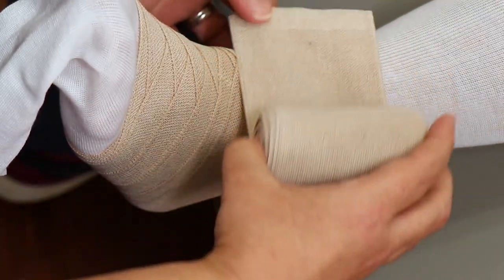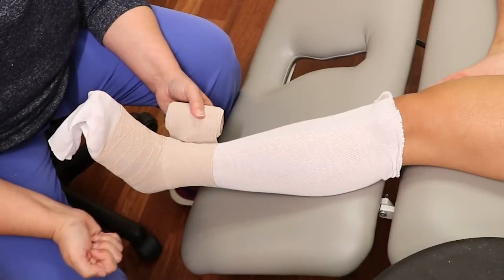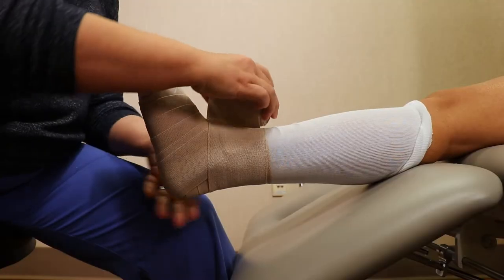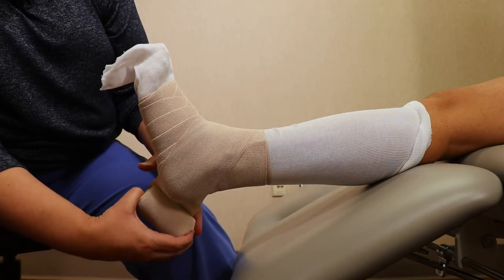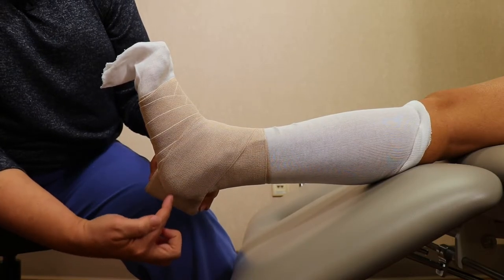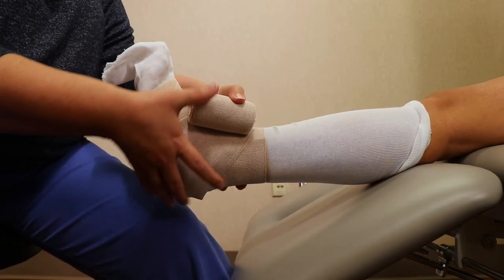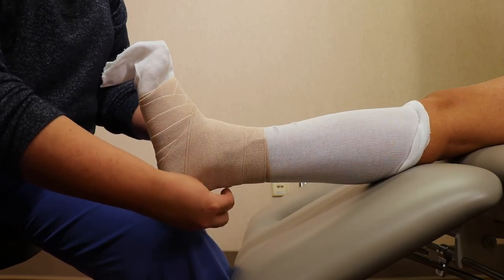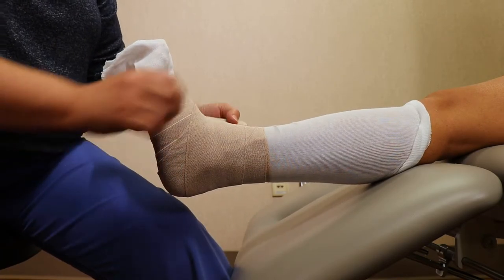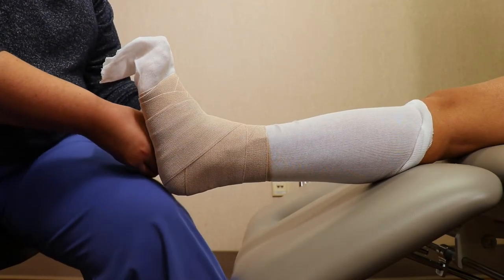Your second bandage begins at the ankle and loops around to catch the end. Then cover the center of the heel so that the center of the heel lands in the center of the bandage. Now cover the top loose edge at your heel and then the bottom loose edge at your heel.